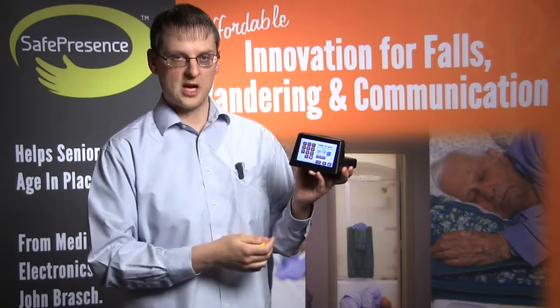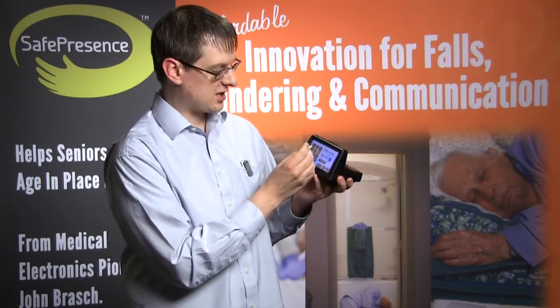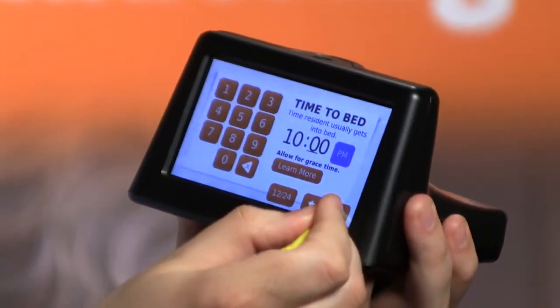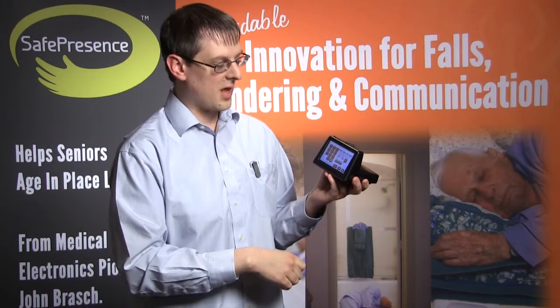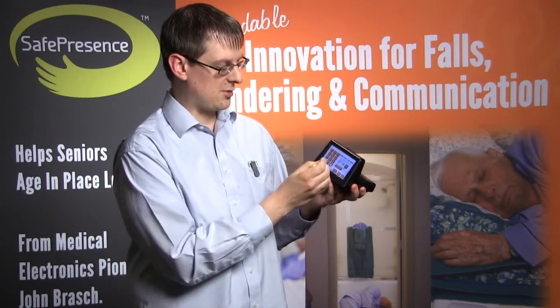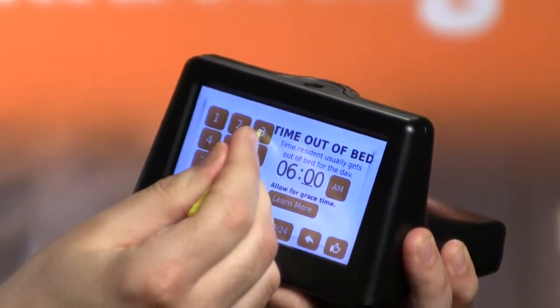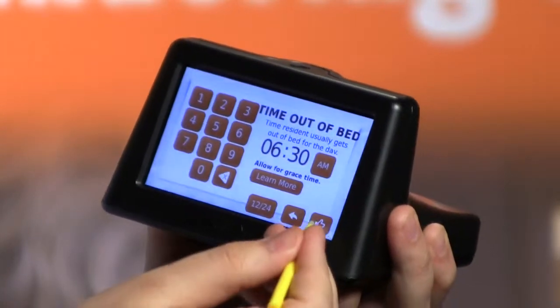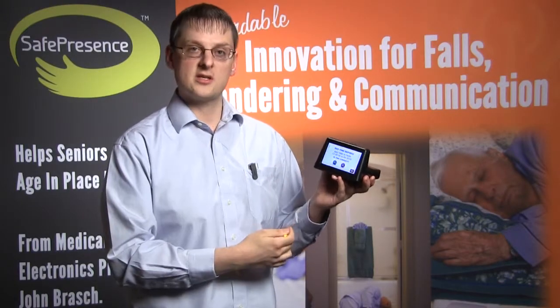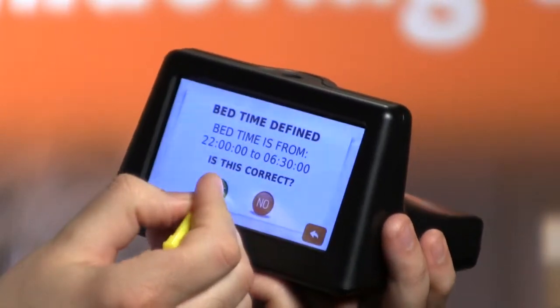And it's going to ask me what my bedtime is. And it's by default right now set up to 9 o'clock p.m. I'm actually going to say that I tend to go to bed maybe a little bit later, 10 o'clock p.m. And my time out of bed. Right now it's set to 7. I'm going to say I'm a little bit of an early riser. Let's do 6:30 a.m. Confirm that as well. And at the end of it, you're going to get a little screen here that says, are you sure these times are correct? So we've got my bedtime, my wake time. I'm going to say yes.